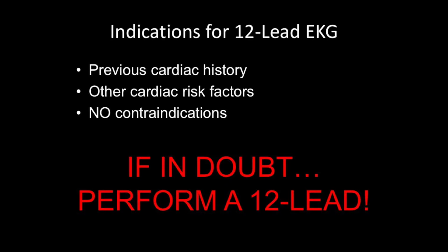So you're looking at about 5 minutes or so. Generally, that should be okay. That should not be something that affects the patient detrimentally. So there are really no contraindications. And if in doubt, perform a 12 lead, just do it.